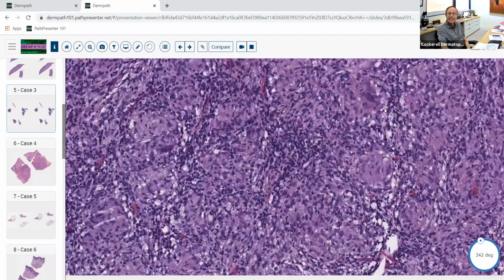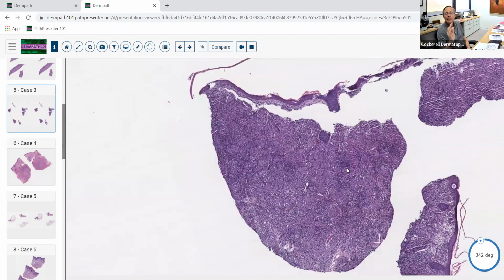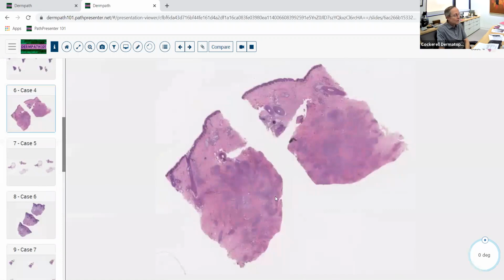One last disease that can sometimes give you sarcoidal granulomatous dermatitis, not usually this intense, tightly packed granulomas, but syphilis, obviously. Syphilis can do just about anything, and it can give you a granulomatous dermatitis. Always remember, the granulomas of syphilis tend to be poorly formed, but sometimes they can look sarcoidal like this. So this is another example of sarcoidal granulomatous dermatitis, and in this case, it was due to sarcoid itself.